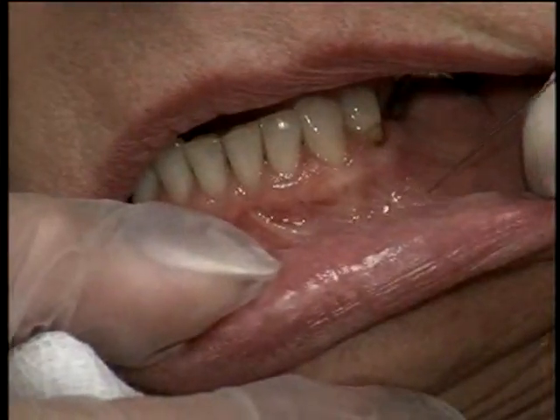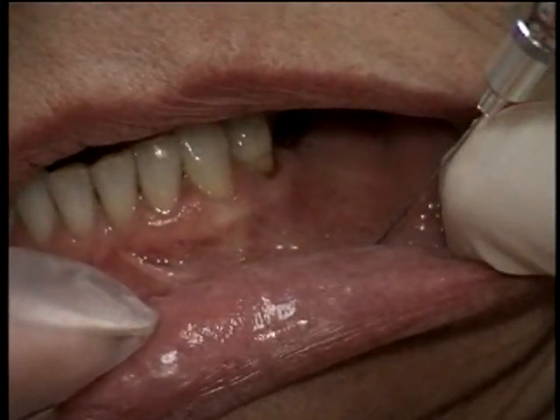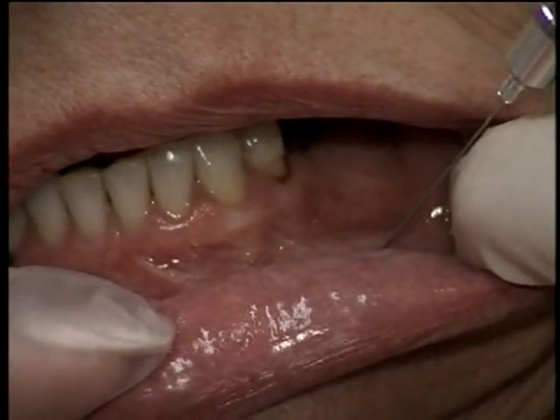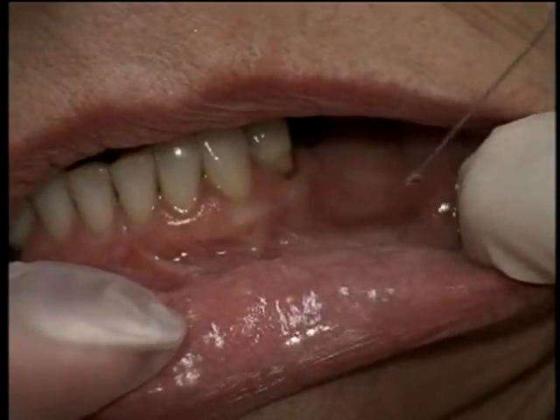So we follow the area of the second premolar right down, and I can actually see the foramen. I'm right next to it. I'm going to inject 1/4 cc right next to the foramen. I'm right on the bone, so I feel the bone. That's it.